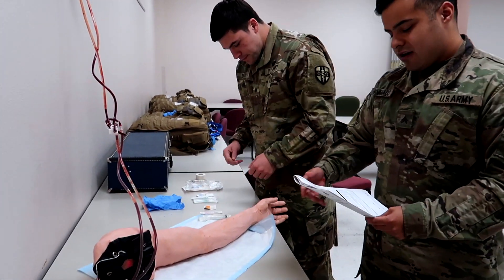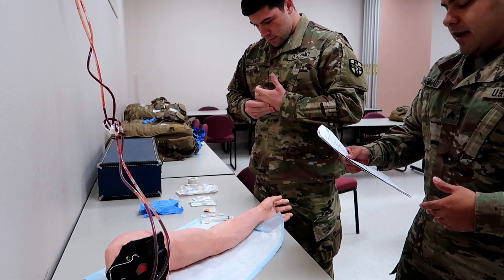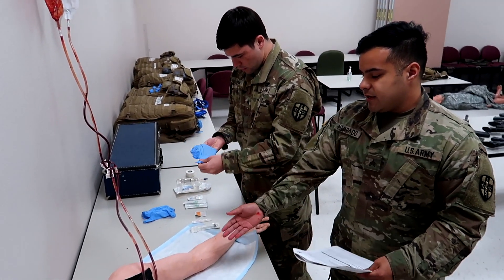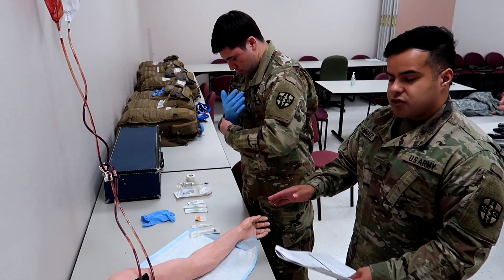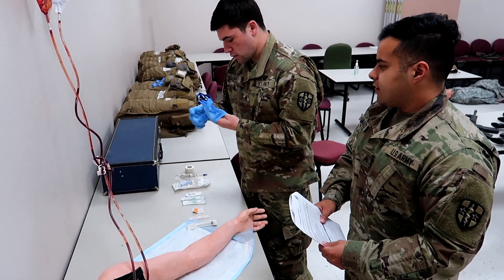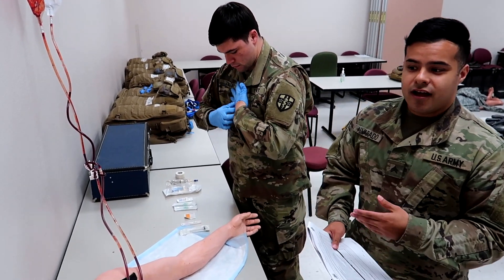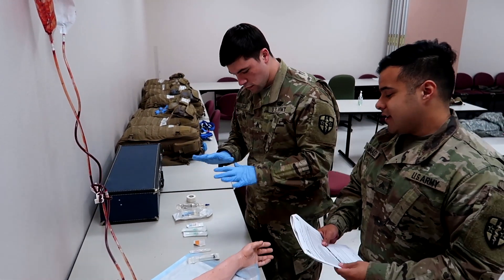Alright guys, so we got our dummy arm right here. I'm going to be reading line by line and as I do that, he's going to be going through the steps. So step one is take BSI — body substance isolation — especially when you're going to be using needles or penetrating skin. You don't want to risk getting the site dirty or anything like that. Gloves are always tricky, especially when you're working with tape because everything sticks together.